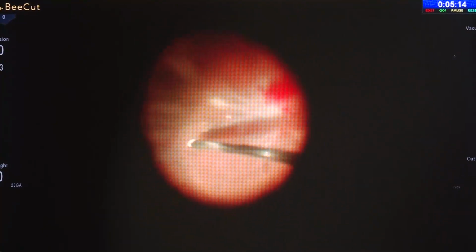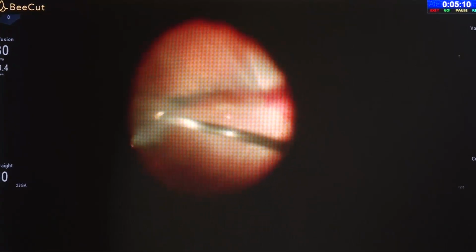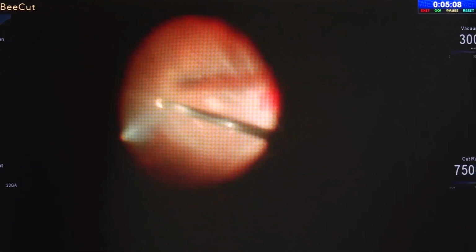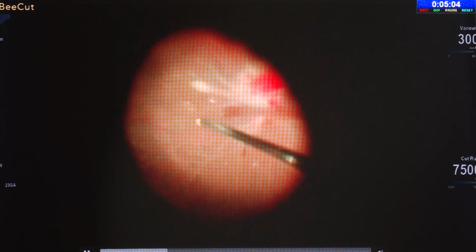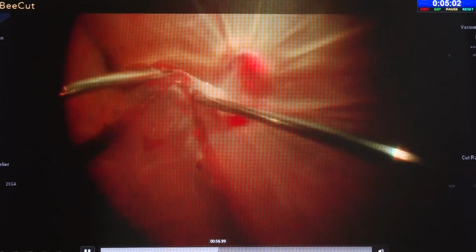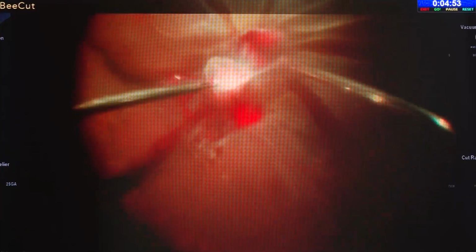That works because after you have done the vitrectomy. I have another video which shows you the combined retinal detachment center to periphery dissection. So here maybe I'll just fast forward this. You remove the peripheral vitreous, and then I have switched to bimanual technique here. You can see this is the stalk which was there inside, and there was another membrane inferiorly. Even this membrane was also inside the retina, like one bunch it had gone inside.